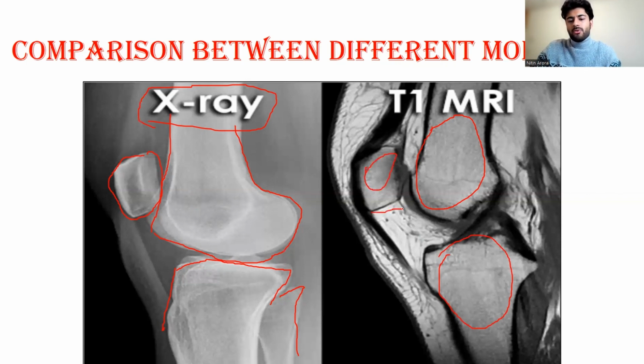Then you also see some fat and some tendon structures, and you see this grayish thing here. These are your ACL and PCL ligaments, which run from the femur to the tibia, anteriorly and posteriorly. So anterior cruciate ligament and posterior cruciate ligament. And then you have fat pouches above the patella and below the patella. That helps in avoiding rubbing or friction with the patella tendon and helps in proper knee functioning.